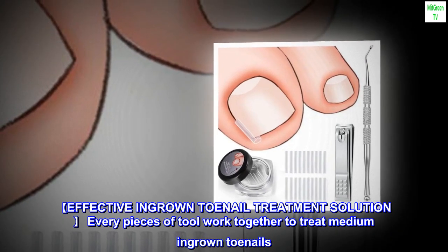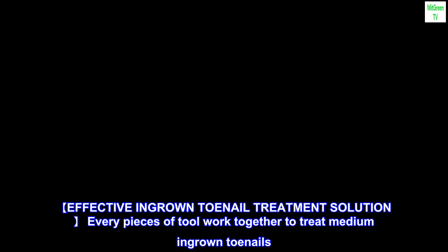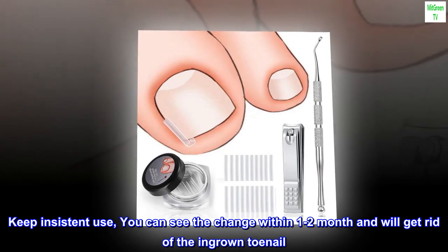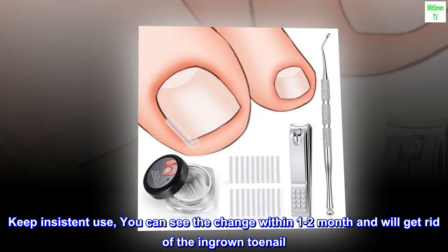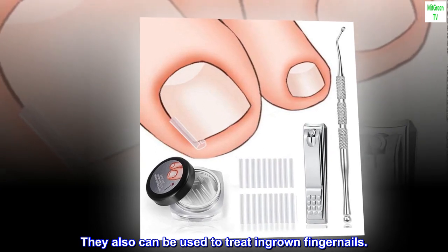Effective ingrown toenail treatment solution. Every piece of tool works together to treat medium ingrown toenails. Keep consistent use and you can see the change within one to two months and will get rid of the ingrown toenail. They can also be used to treat ingrown fingernails.